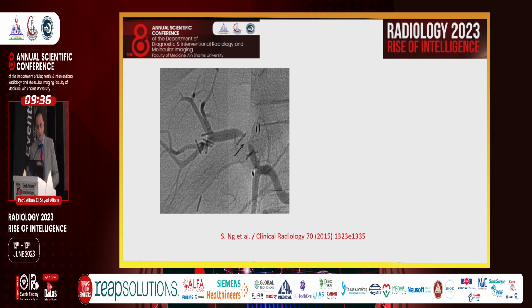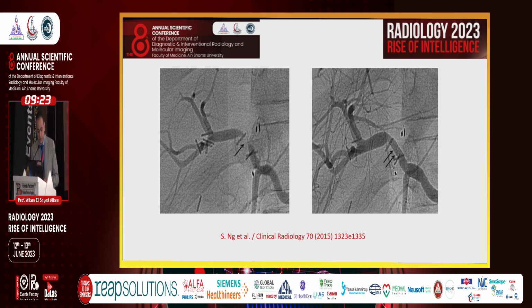Hepatic artery stenosis can be presented anatomically, like in this case, with no damage to the distal blood flow of the hepatic artery. In these cases, we have more than 50% diameter reduction, so dilatation with stent insertion can resolve this condition.